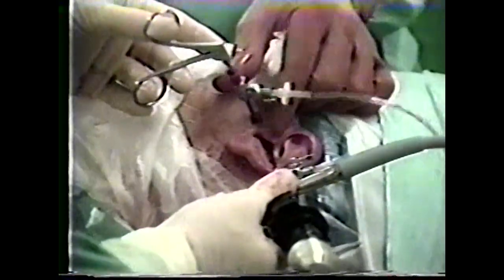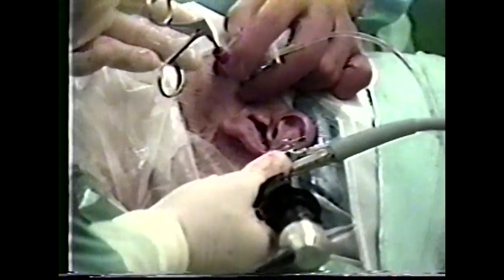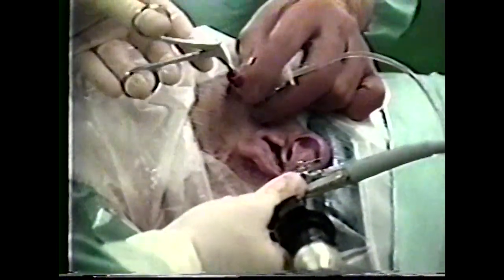Having an assistant stabilize the instrument cannula while working will steady the instrument in the joint and prevent exaggerated motions.